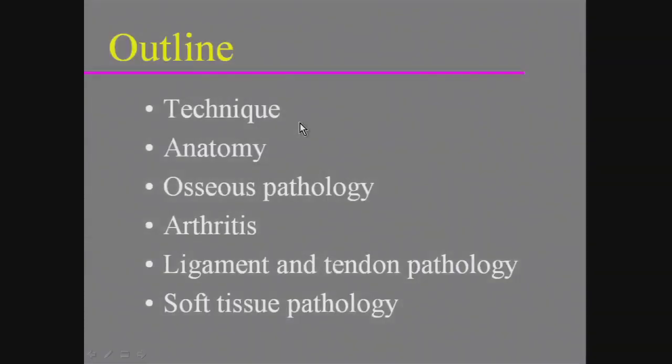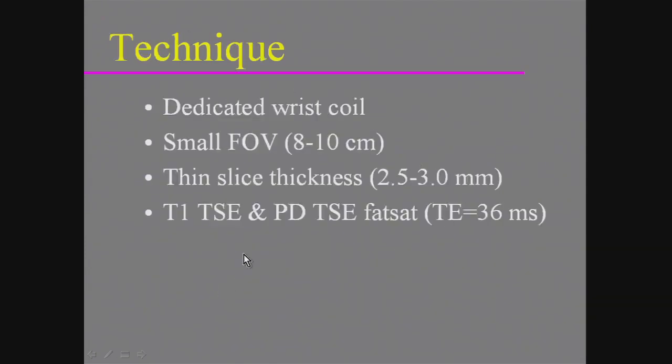So I'd say in the last, I don't know, 5 years or so, probably the fastest growing segment of our diagnostic MSK practice has been imaging the digits, the fingers and the toes. And this lecture is going to focus on finger injuries. So in terms of an outline, we'll talk a little bit about technique, the unique anatomy of the fingers, and then a spectrum of traumatic pathology in the fingers.